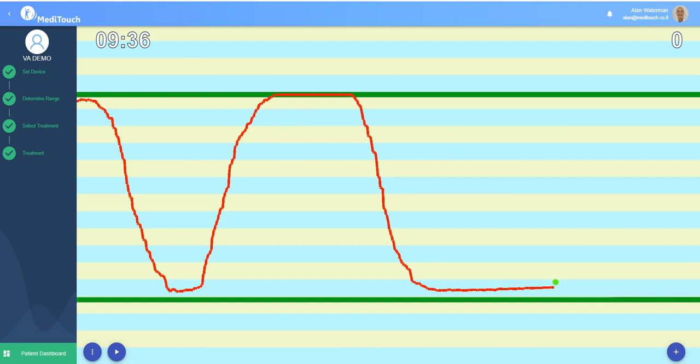So that's even in a clinical session or in a demonstration setting. The reason that you don't have to drill down in the early explanation and waste time in the early explanation, and you can impress with explaining that the system is a complete turnkey solution to functional tasks.